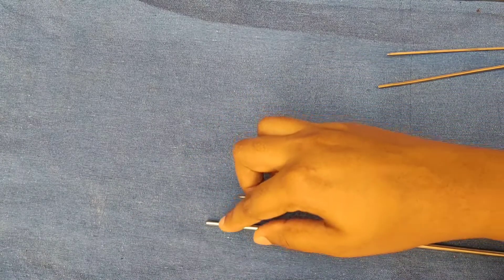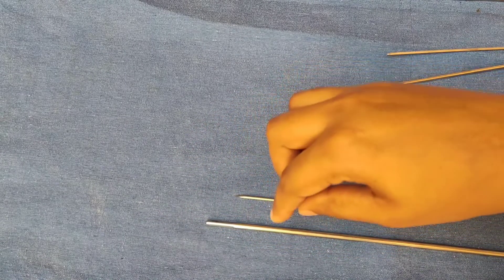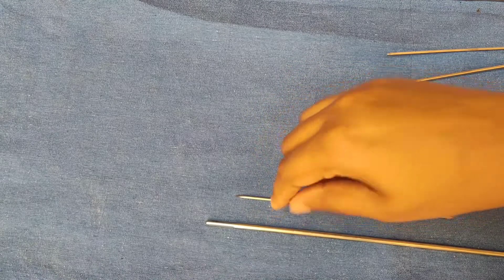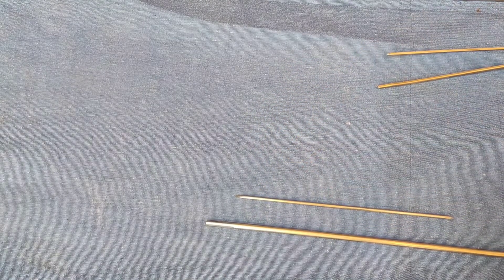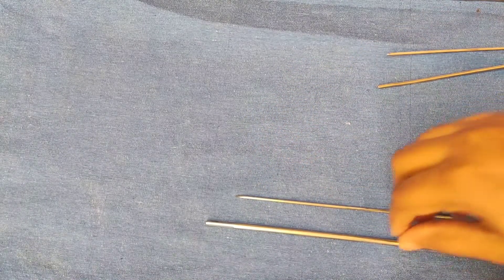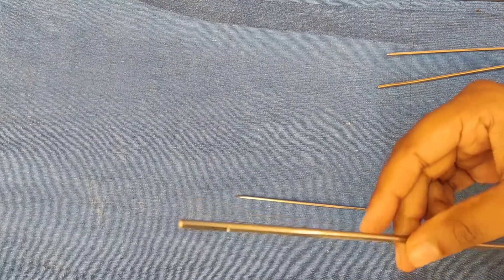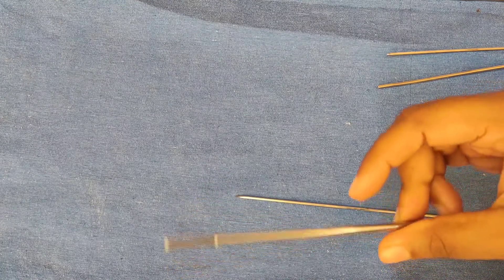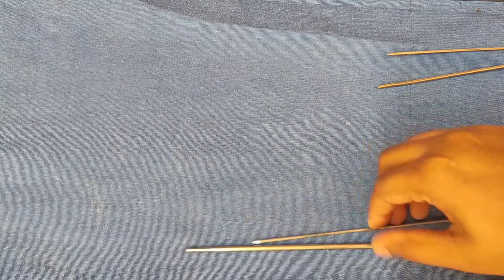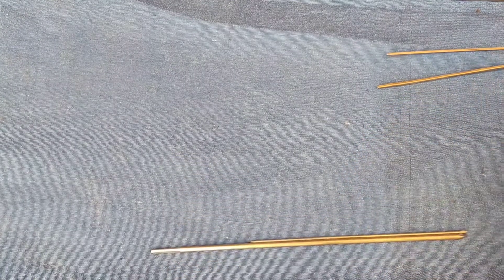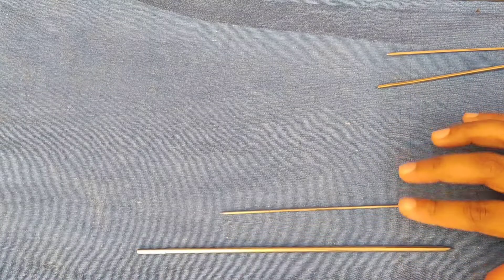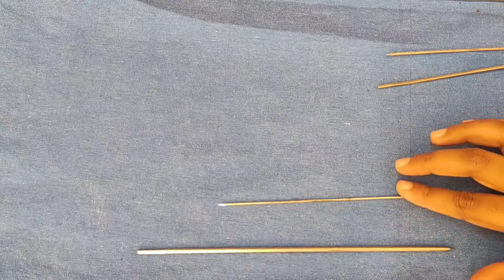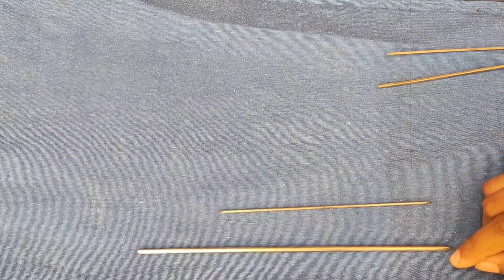The sizes available for a Steinmann pin range from 3 to 6 mm at an interval of 0.5 mm. The main uses: it is used for skeletal traction in good quality bone. The lengths available range from 15 to 30 cm at an interval of 5 cm.